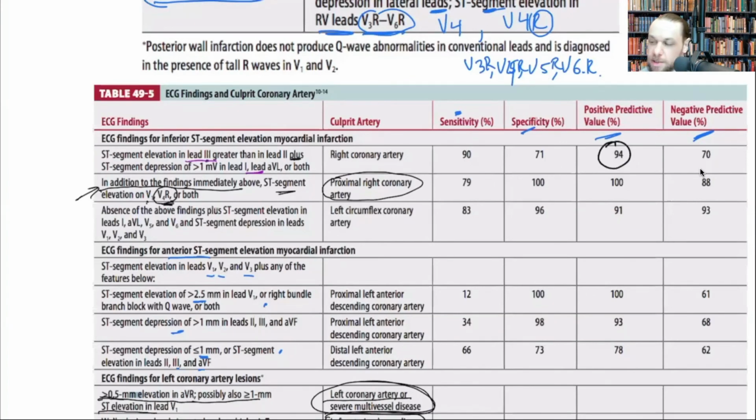You could make a presumptive diagnosis based on this chart, which is usually correct. Meaning you're not going to be totally off, but there's variability in which coronary arteries are involved when they actually get to the cath lab table. So from your standpoint, you cannot tell 100% what's what. You could have a good idea.